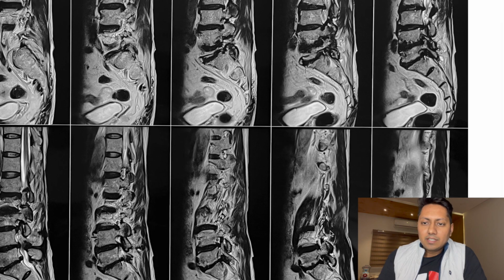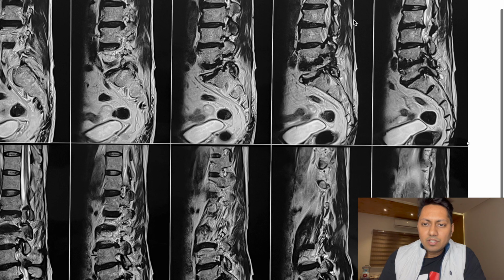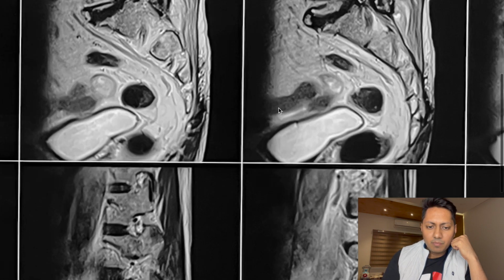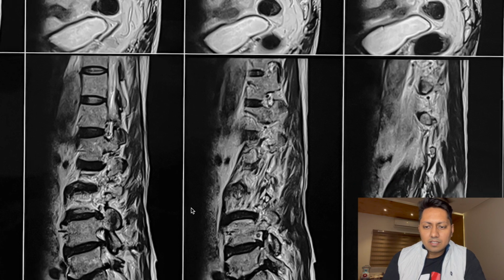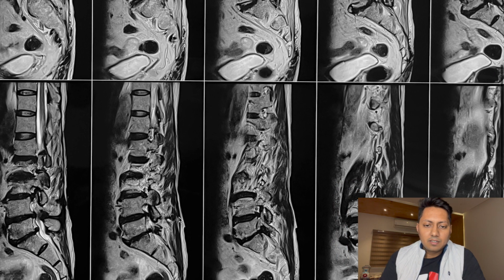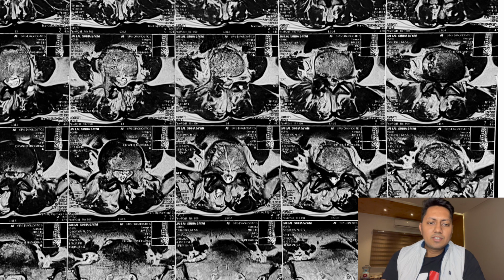Comparing the right side nerve root to the left side, this is the right side image. You can see the exiting root L4 is quite compressed here, and if I compare the same exiting nerve on the left side, you can see how well open this foramen is. So by these sagittal cuts, I have come to the conclusion that only L4 and L5 nerve roots need to be decompressed, and I'll take you to the axial cuts.